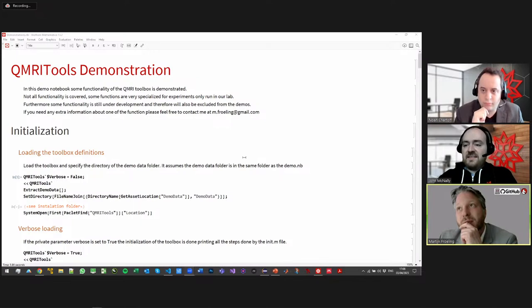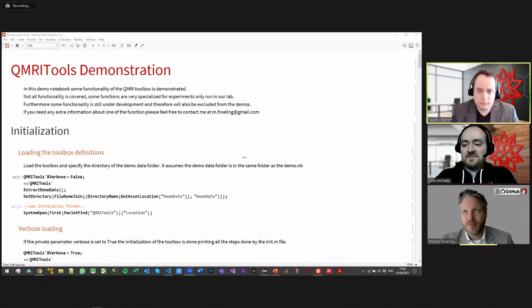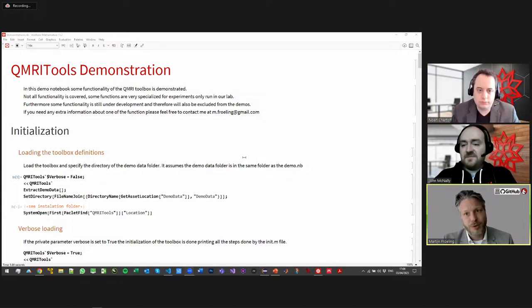Really depends. When you typically look at anatomical imaging, it depends on the resolution you take. For example, you take a head 20 by 20 centimeters. Typical resolutions would be 1 by 1 by 1 millimeter. So we're looking at a volume and not a cross-sectional photograph; we really measure volumes. Then the data set would be, say, 128 by 128 by 128 voxels, and that would be around 30 to 40 MB, but when we do quantitative measurements, it can go up to 500-600 MB per data set. And if we really take the raw data into account, it can be gigabytes. So that amount of data can vary quite a lot. It also depends what kind of models we're using. Some models need a lot of data, some models only need a few data samples.